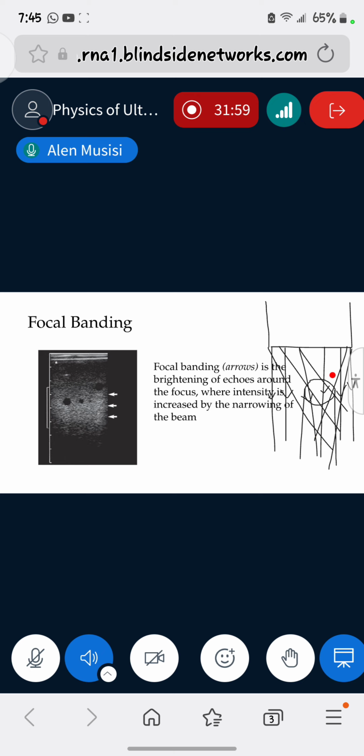So these transducers sending these beams in other directions to make sure that they go also around this structure is what we call spatial compounding. Is that clear now? Yeah, so clear.